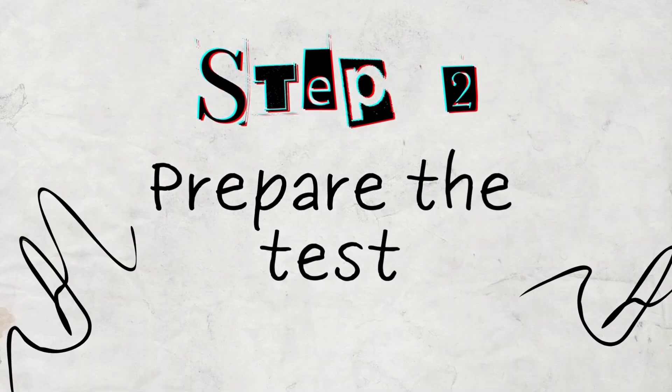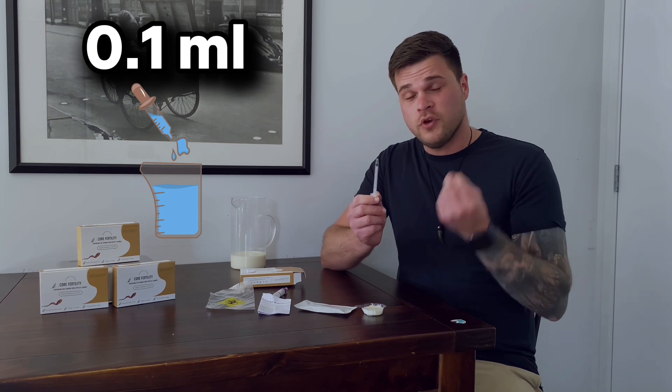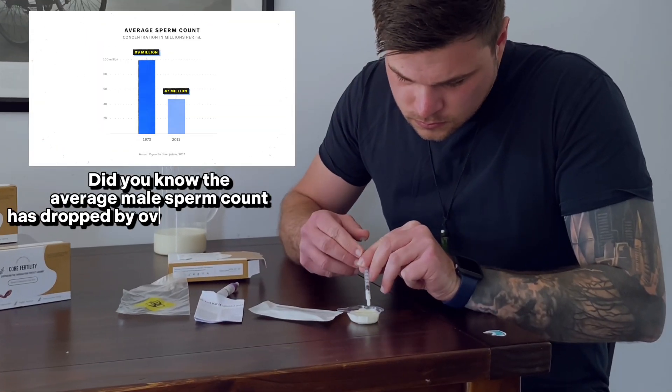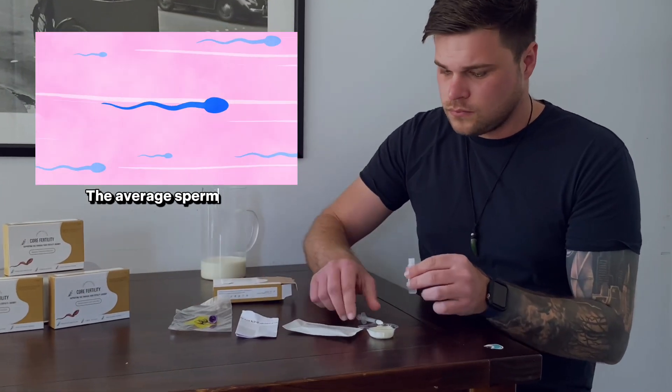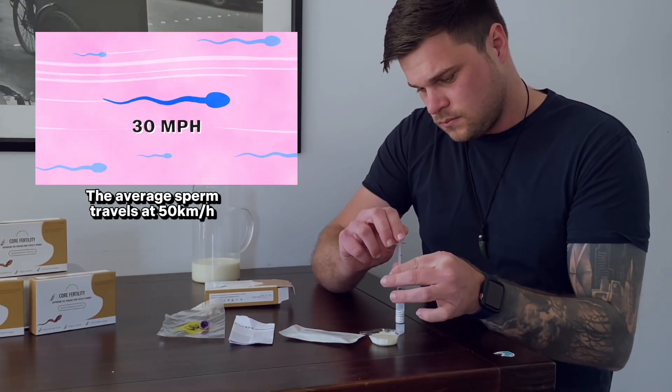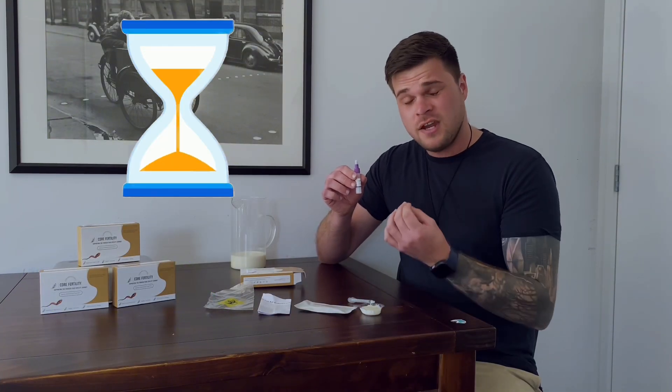Step two: prepare the test. Using the provided syringe, draw 0.1 ml of your liquefied sample — it should look something like this. Next, add the sample to the dilutant that you'll find in the kit. Once you've added your sample to the dilutant, you need to mix the solution. To do this, just turn it upside down about five times. Once we've mixed it, we just let it stand for two minutes.